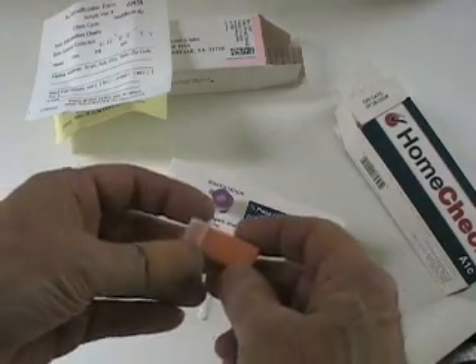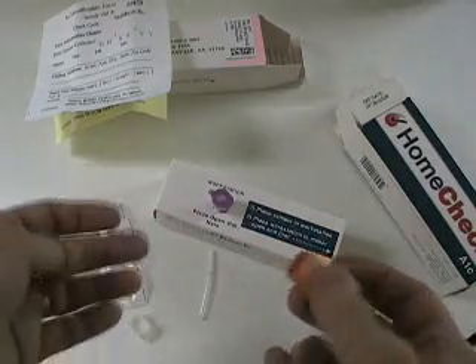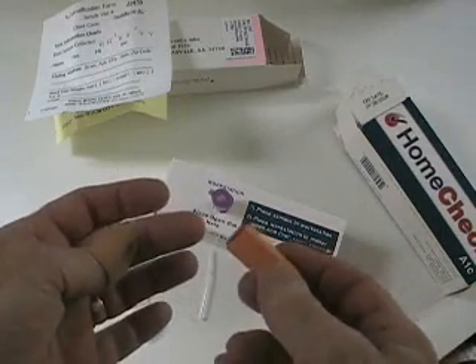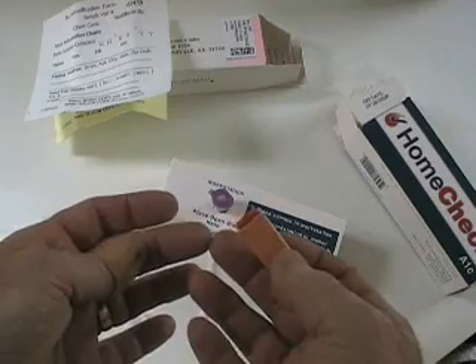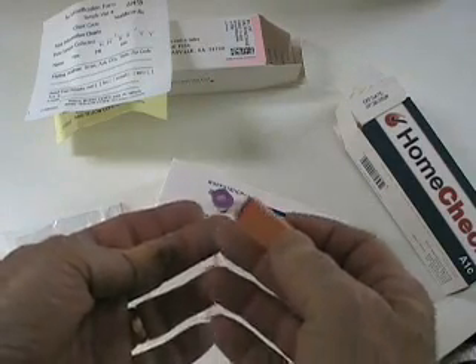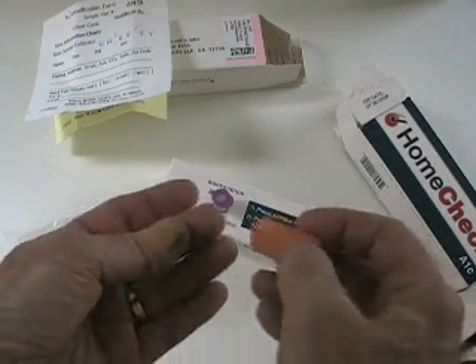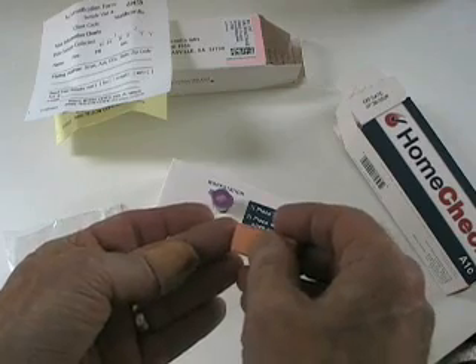This thing is already pre-primed and ready to go. I don't know if it shows in the video, but my fingers are pretty badly scarred from continuous blood samples. So instead of using the sides of my fingers, which I would normally do for less pain, I'm going to use the tip here. It's pre-primed, I hope.